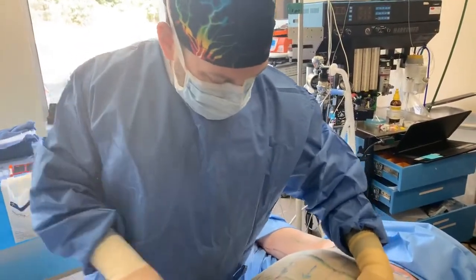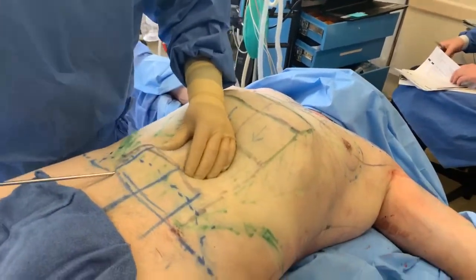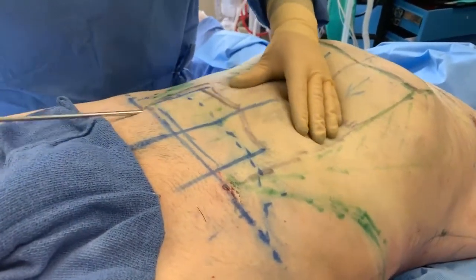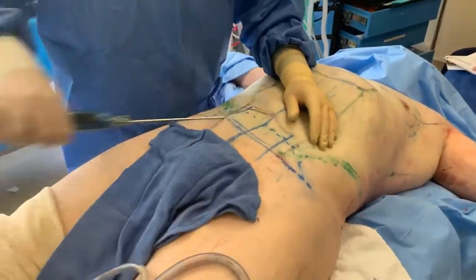So this is what happens after you've done ultrasound removal — you go in there and then the fat easily comes out nice and gently. You can get rid of those problem areas and give him a flatter, tighter look.